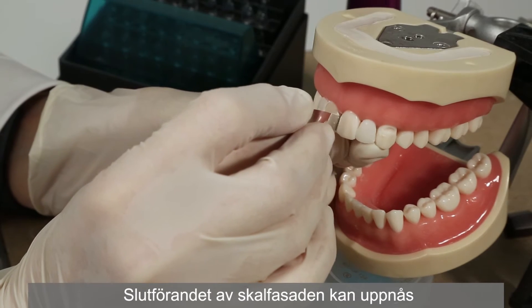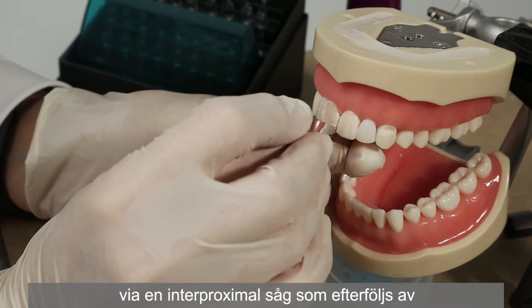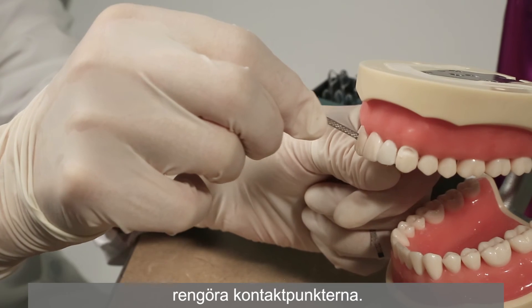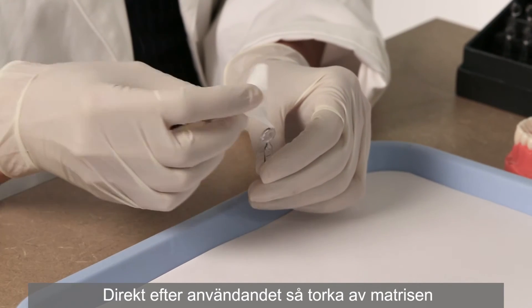Finishing the veneer can be achieved with an interproximal saw followed by interproximal polishing strips to allow for clean contact points.